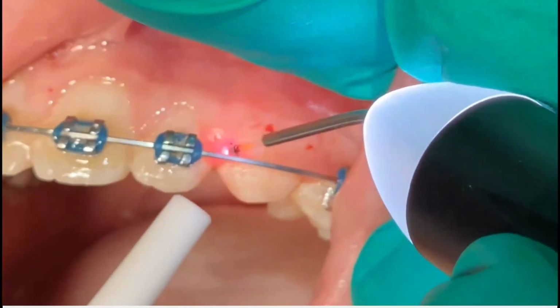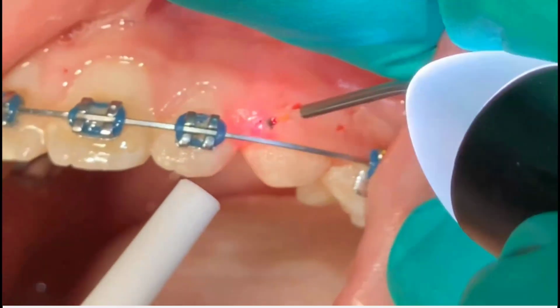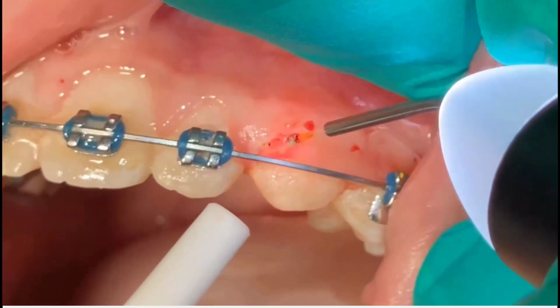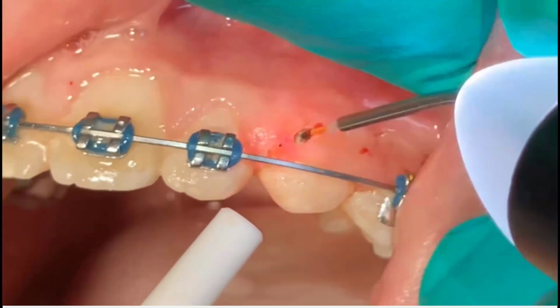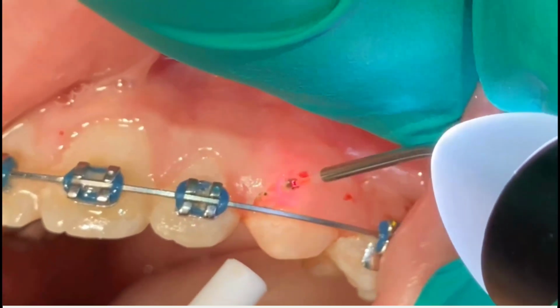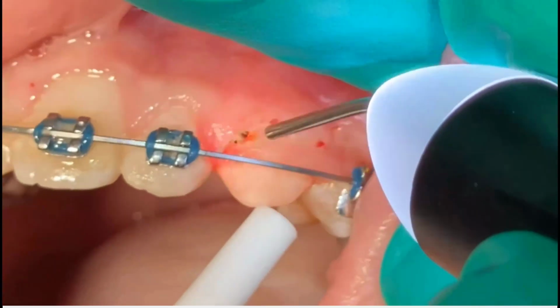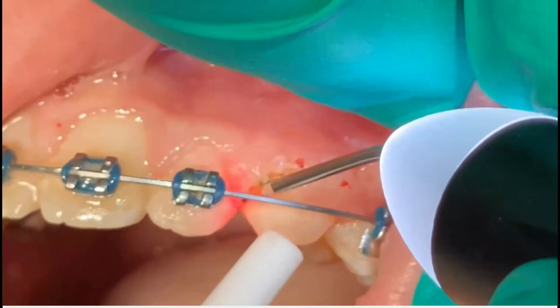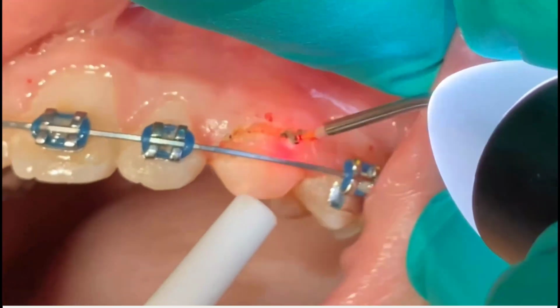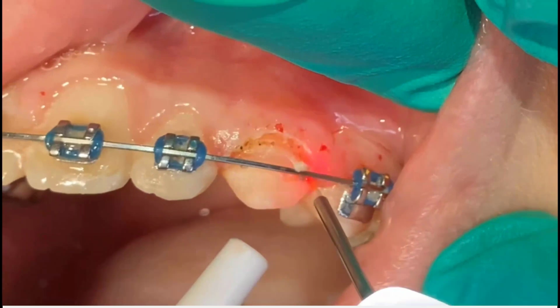Because the energy is not absorbed by hydroxyapatite, I can actually lean on the tooth here and press down on that laser and carve out the tissue the way I want it to be. The tissue is moderately thick here as well. Watch how cleanly this happens. This is unedited video, so you can actually see exactly how this happens. My successes and mistakes are all in these videos. And what you're not going to see is too many mistakes, thank God. Despite that, you'll see how clean it is.